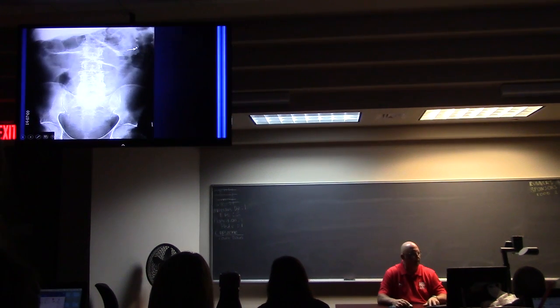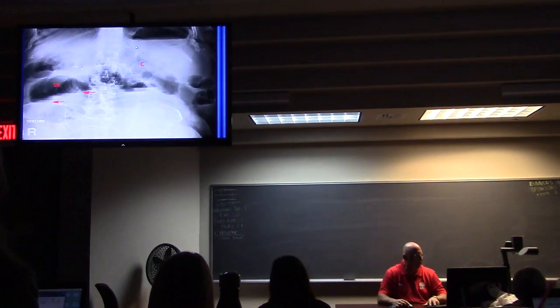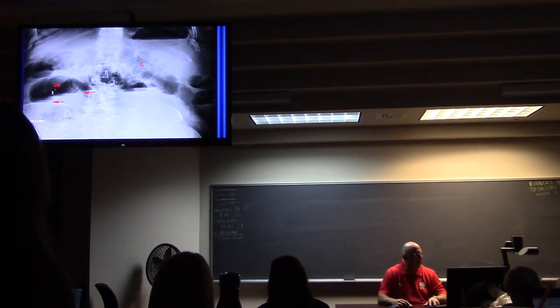This is called thumbprinting along the colon. This is not stuff I really want to talk about. Air fluid levels. Looks like a coin stacked up on itself. Suggests a mechanical obstruction.